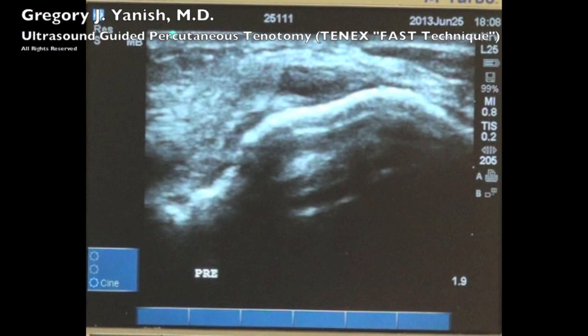Here's the ultrasound image that I'm visualizing. You'll see a bright white line in the middle of the screen — that's actually the bone or the lateral epicondyle. Immediately above it, which will be marked with an arrow, is the tear of the common extensor origin. This black area is actually the tear or the injury to the tendon that will be removed during this procedure.